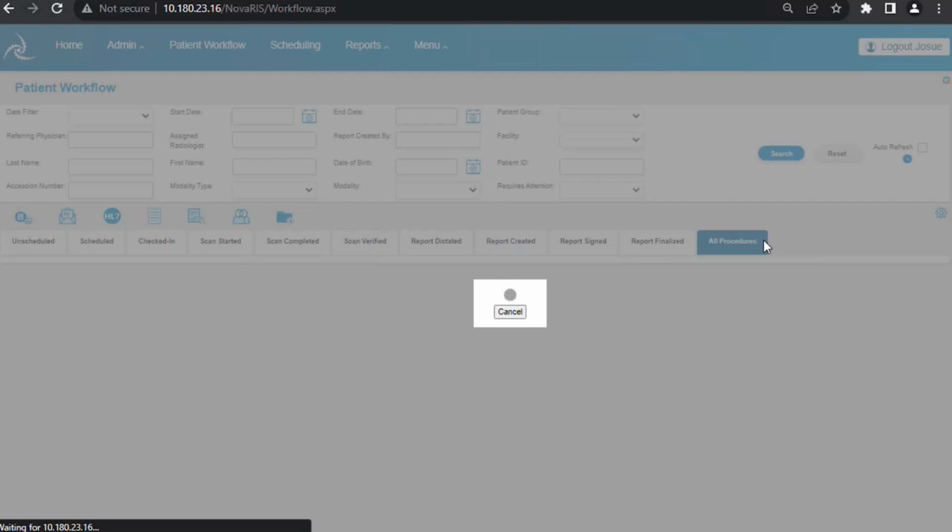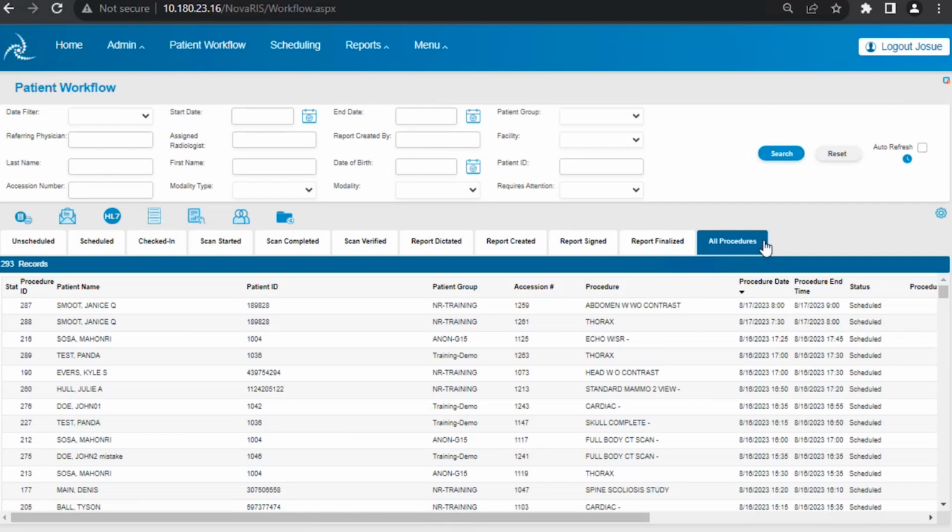So in this case now, it's time. If anyone has any specific questions, we will gladly answer them. If you have questions, you can put those in the chat. Don't have any yet. So Josue, could you show us the NPI registry while we're waiting, in case someone has a question, and I'll give them a little more time to ask it?